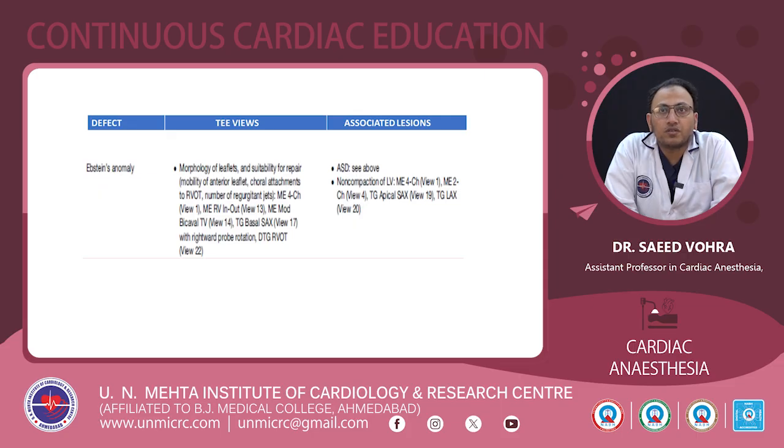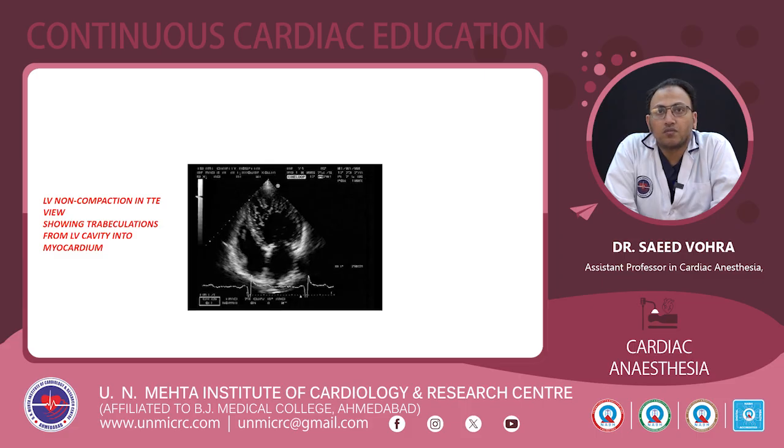There can be non-compaction of the LV, which can be seen in the mid-esophageal four-chamber view, mid-esophageal two-chamber view, transgastric apical short axis view, and transgastric long axis view. This is a transthoracic image of the LV non-compaction seen in patients with Ebstein anomaly. We can see LV non-compaction, and the trabeculations from the LV cavity into the myocardium.